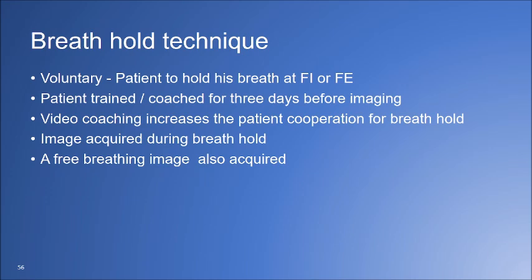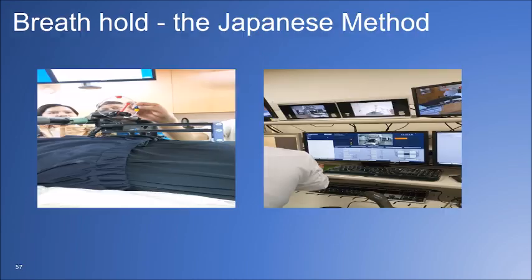Images were acquired in breath hold position and also in free breathing position. The plan was done on both, and if breath hold improved the dosimetry, then the patient was treated in breath hold. When I visited Japan about 5 or 6 years ago, they had a different breath hold method.